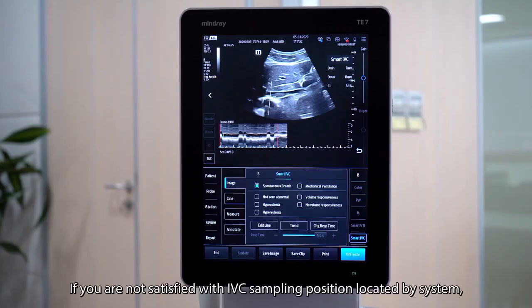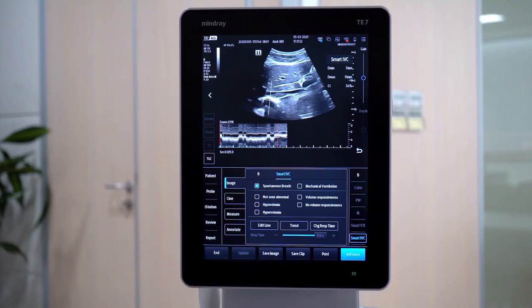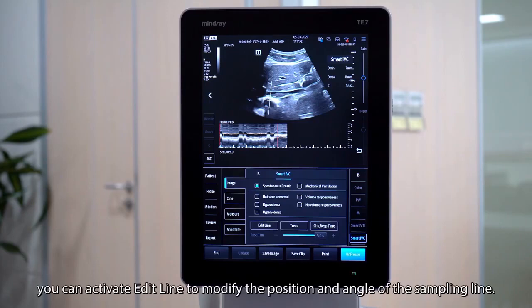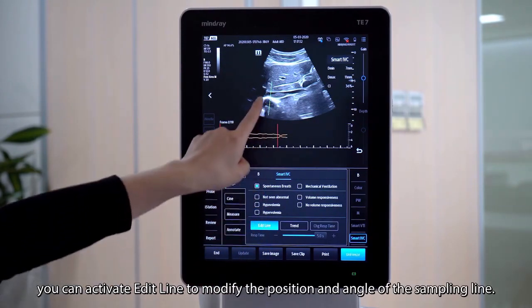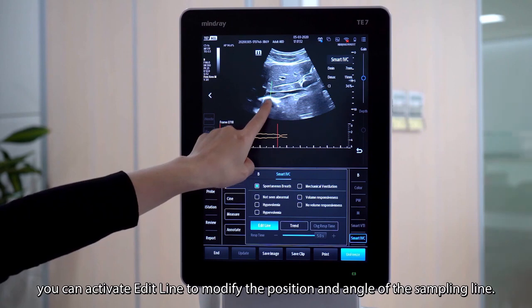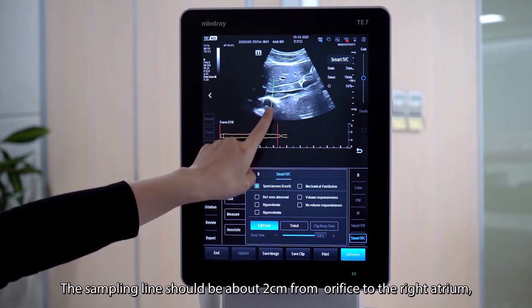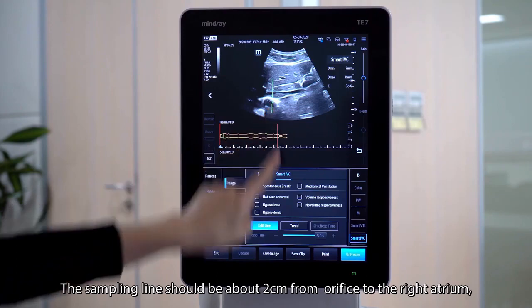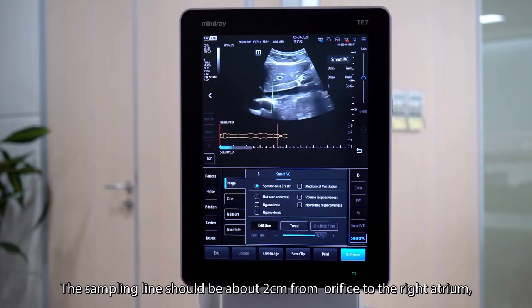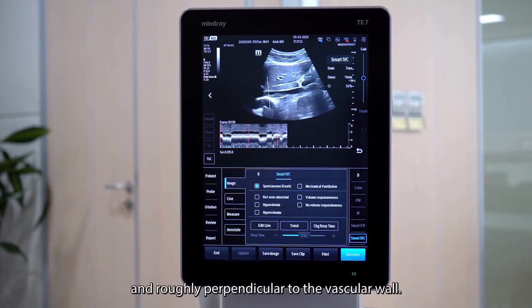If you are not satisfied with the IVC sampling position located by the system, you can activate the added line to modify the position and angle of the sampling line. The sampling line should be about 2 cm from the IVC orifice to the right atrium and roughly perpendicular to the vascular wall.